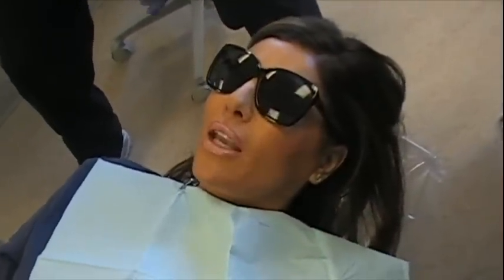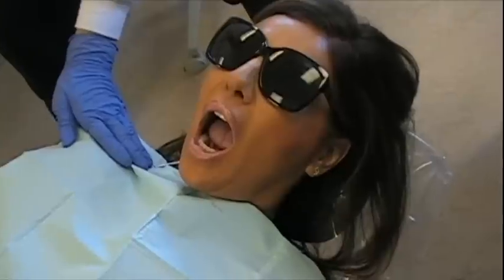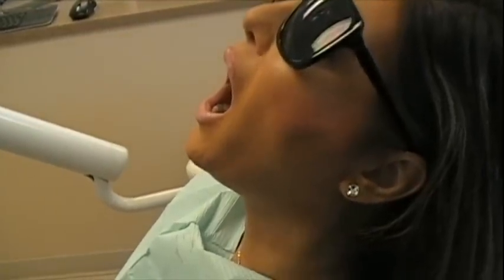When you're done with the injection, instruct the patient to stay open for at least a minute. I like to give the patient a bite block to help them maintain that position. This is an important part of the injection — they need to stay wide open for at least a minute for it to work. This injection works really well; I use it for patients that don't get numb on the IA very easily and it has a very high success rate.